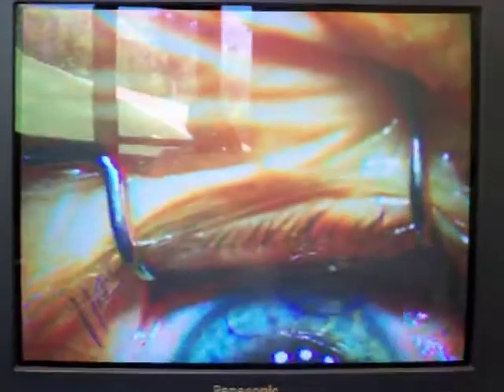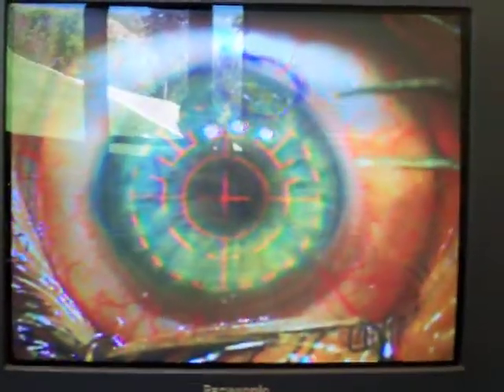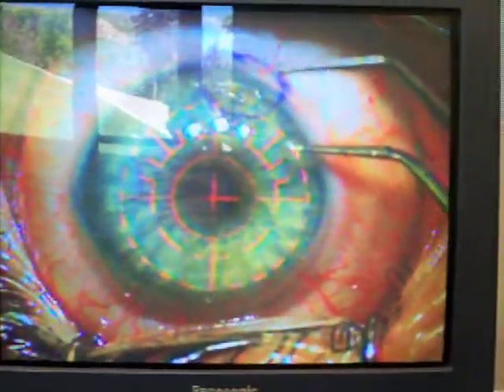And that just created the flap as it went through there. Pull the full thing off all at once. Wow. And I'll just line it up here. I'll go underneath there and just lift that flap up, pull it back. Smooth as can be. Wow.